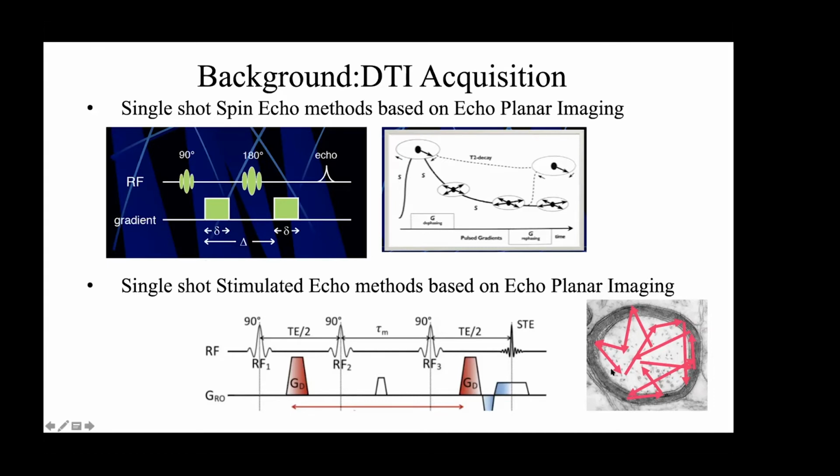The idea behind it is that the longer we observe, the more we are going to be able to detect as these particles interact with the membrane. So that means you will be able to see differences between different size fibers. For instance, with atrophy you may have a smaller fiber, so maybe the effects are larger if you see the diffusion mobility after you observe it for a longer period of time. So we are using both these sequences.